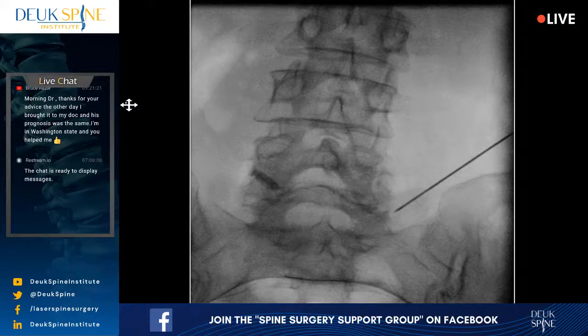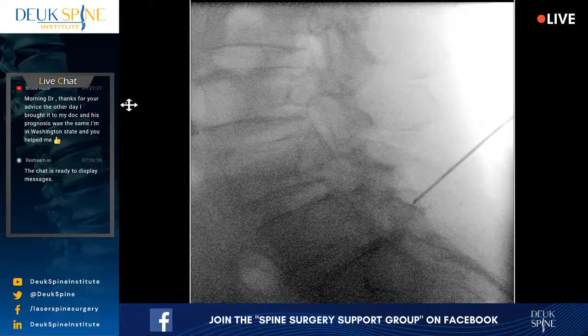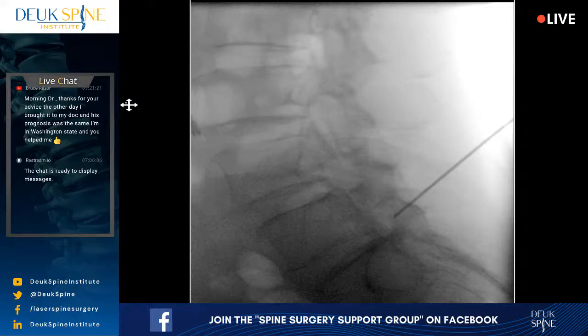Her spine is, unlike some of the other spines we've done recently, very posterior, lateral. It's located back towards her skin. That's the best way to say it. So it's closer to the surface of her body back here. Whereas the last patient we did on Tuesday, his spine was very anterior, way far away from where we are. Hers is very posterior. So the opposite.